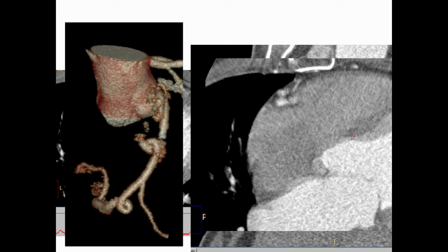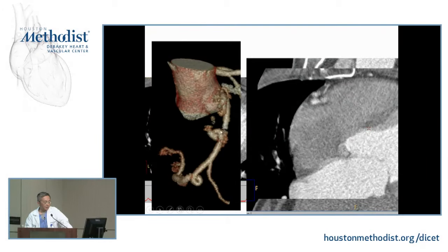This is another interesting case. It looks like this patient had motion, right? It's almost impossible to have three vessels going on. You know, the RCA is only one RCA. You can't have three RCAs. Okay, so it was surprising because the patient's heart rate was very stable. As it happens, the patient had a very, obviously, kinky RCA, which is a really important point.